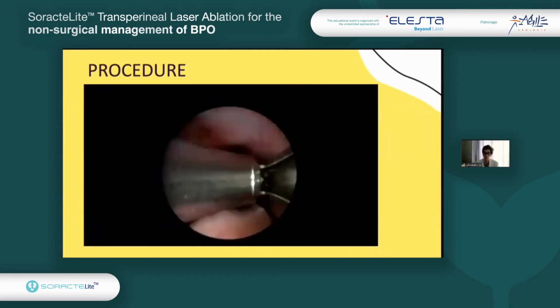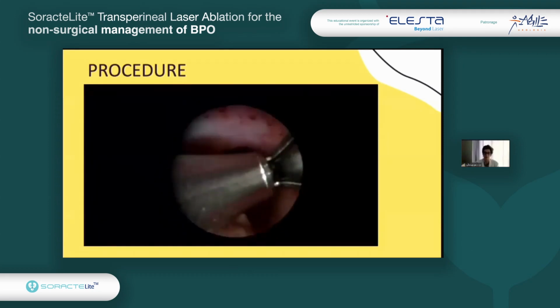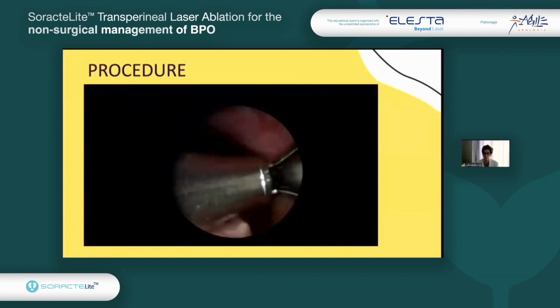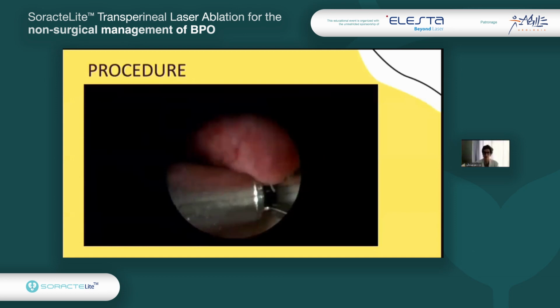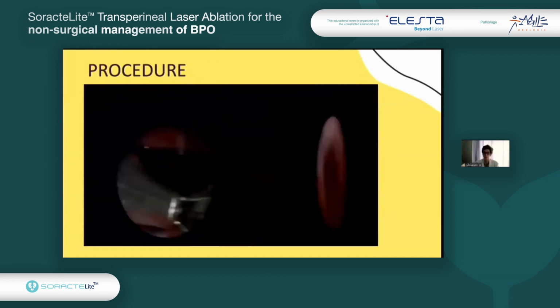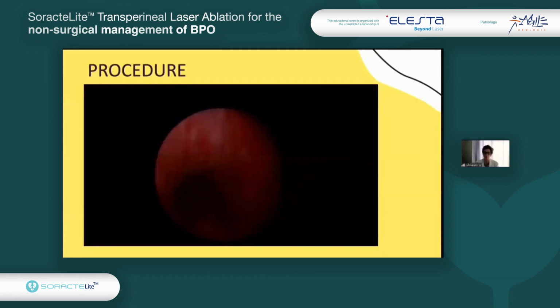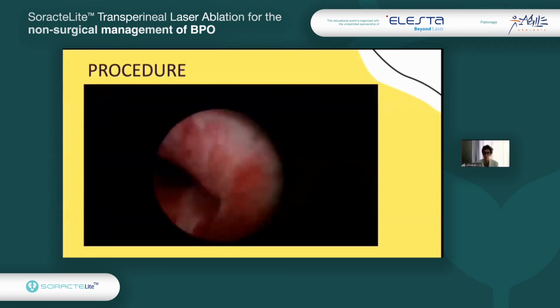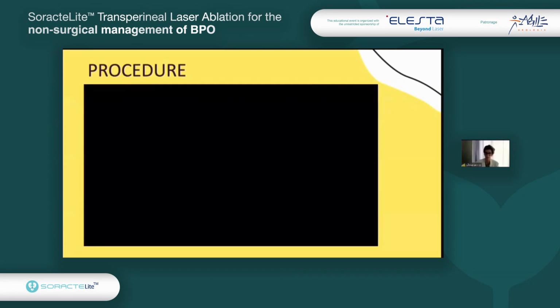We gave the patient antibiotics before the procedure, and we suggest the patient maintain the therapy for another 4 or 5 days. As you can see in this particular patient, no hematuria is happening. Hematuria is very, very rare. Also, catheter placement is very uncommon, because urinary retention occurs in less than 5% of patients that we treat. And at the end, we perform another cystoscopy to verify that we have obtained a good channel.